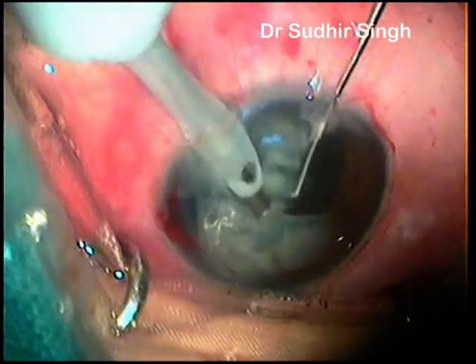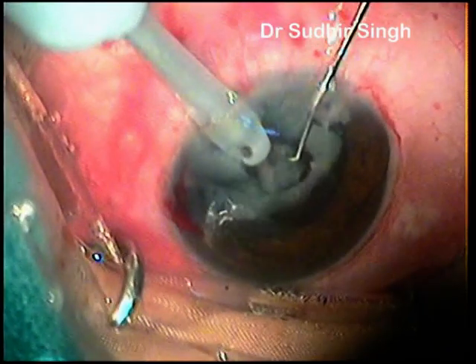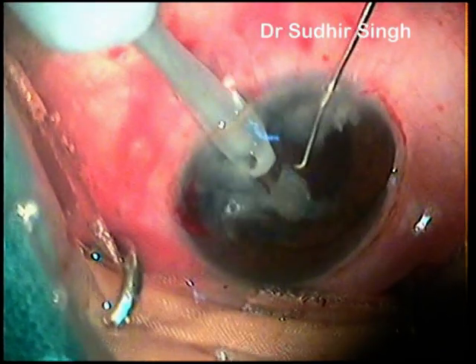Phaco settings used in this case were as follows: Vacuum 350 mmHg, Phaco Power 50%, Aspiration Flow Rate 32 cc per minute.